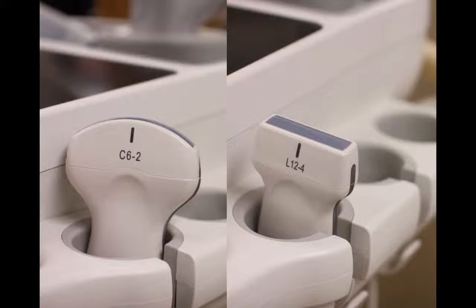I personally prefer the linear probe, and I think most people do because it gives you the highest resolution image. However, the depth of the linear probe might not be what you need in some of your patients that are a little more obese, in which case a curvilinear probe can be useful.